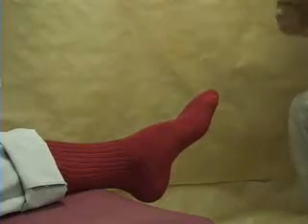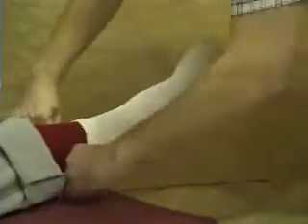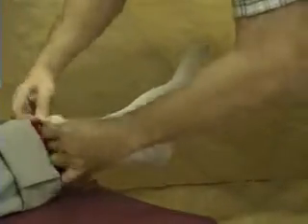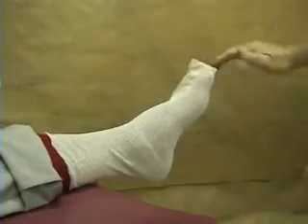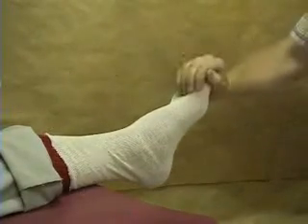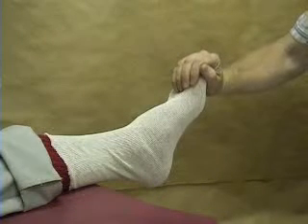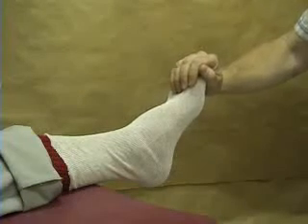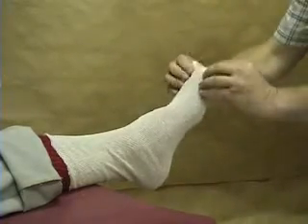We'll begin by putting a stocking guard on top of the sock. That just protects the sock and makes it easier for the cast to be removed later. We need to also form a toe cap over the toes, and the reason for doing that is to protect the toes while the casting material is going on, and it also reinforces the end of the boot.